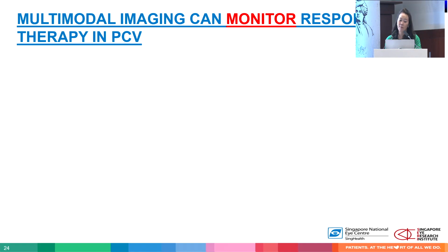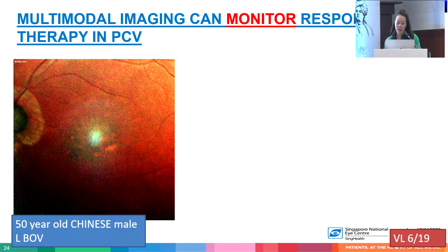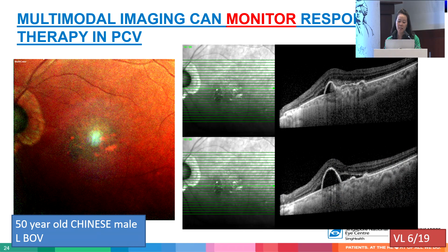And not only that, but multimodal imaging can also monitor response to therapy in PCV. This is a 50-year-old Chinese male. He had left blurring of vision. You can see a nice peaked PED with a little bit of the ring.